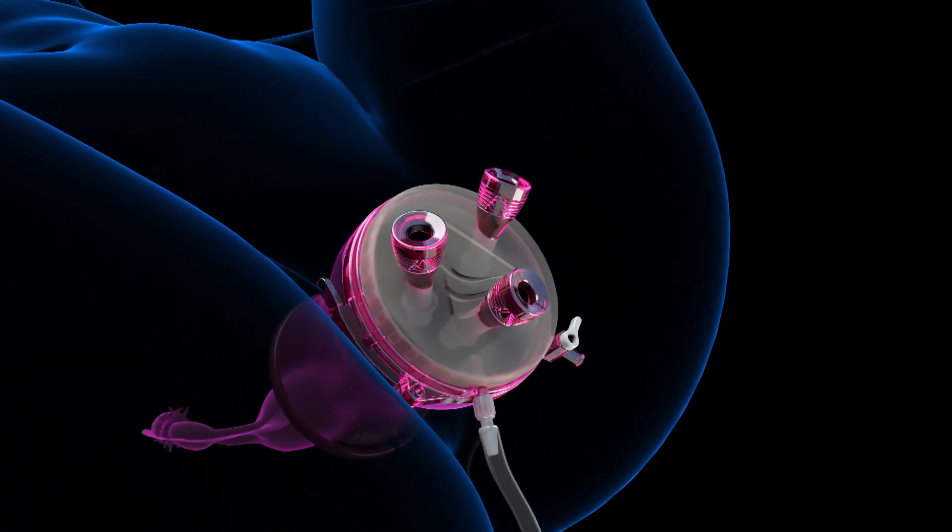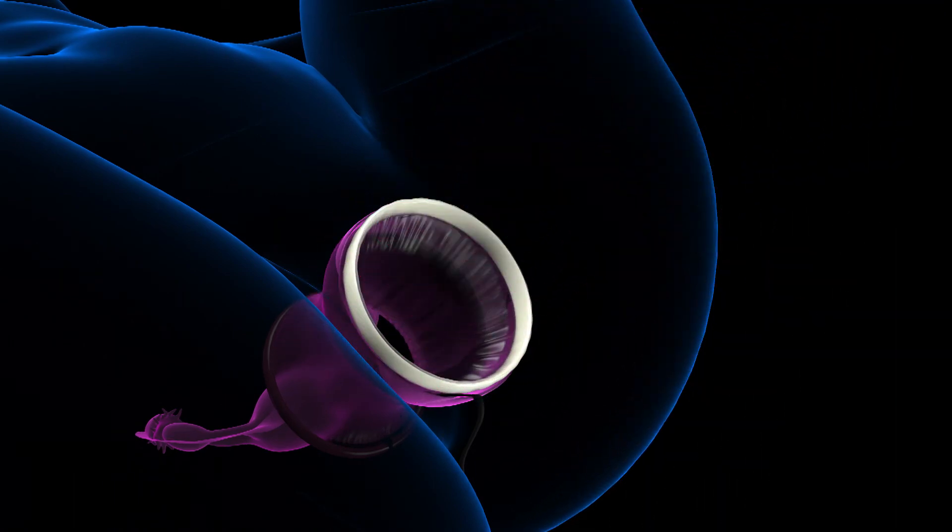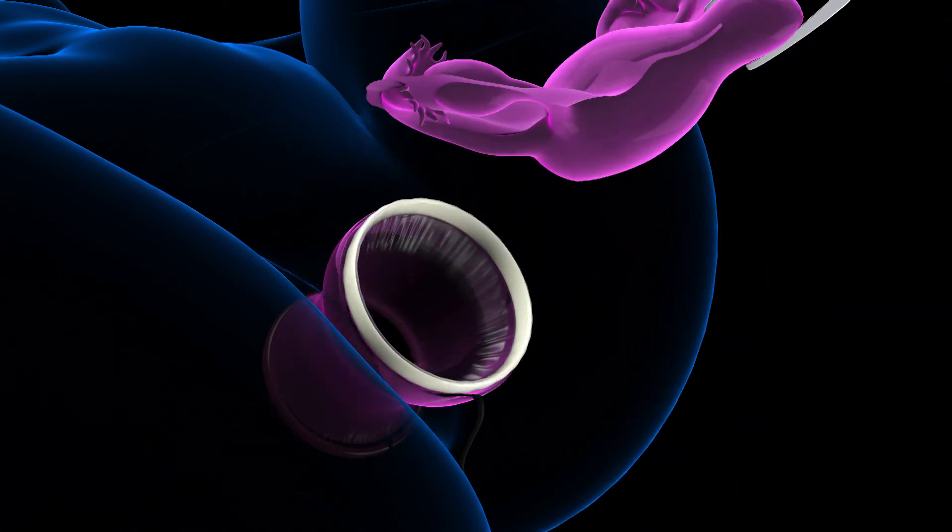The gel seal cap lever is opened and the cap is removed from the Alexis retractor. The specimen is then removed transvaginally.